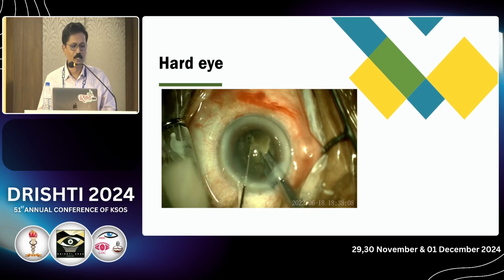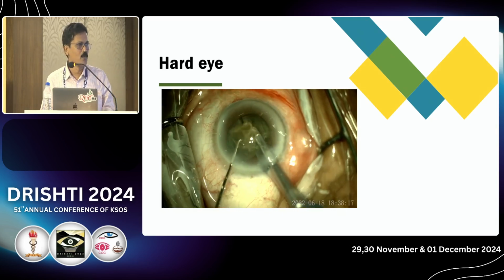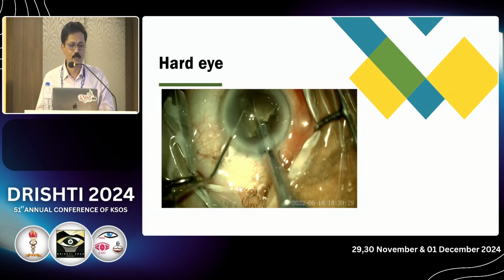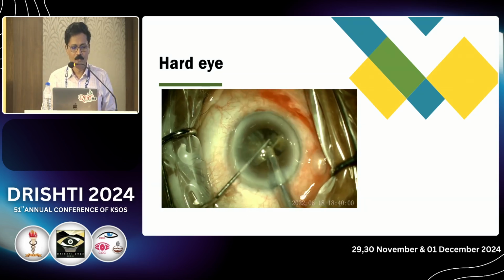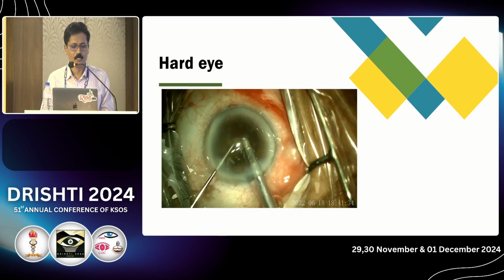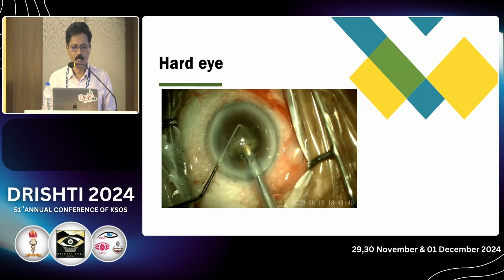But what is important is that at the end of the surgery or the next day, you have to do an indirect ophthalmoscopy. And after 2 weeks, a regular indirect ophthalmoscopy with scleral depression. So at the end of the surgery, though we have struggled so much, only the little bit of iris stretching which is there in the subincisional area, otherwise it looks okay.